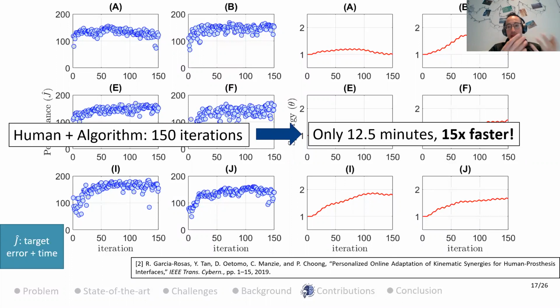You could target different tasks, not just one single reaching motion, and it's only one tuning for all these people. So you just need to tune the algorithm once. The clinician would not be involved in tuning this algorithm at all. So pretty exciting results. And yeah, that was published in Transactions on Cybernetics, if you're interested to have a look at a bit more detail.